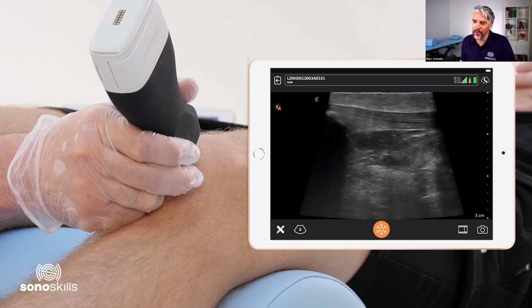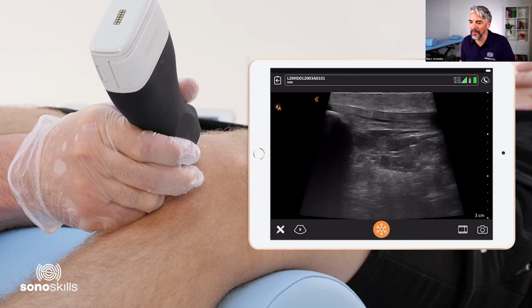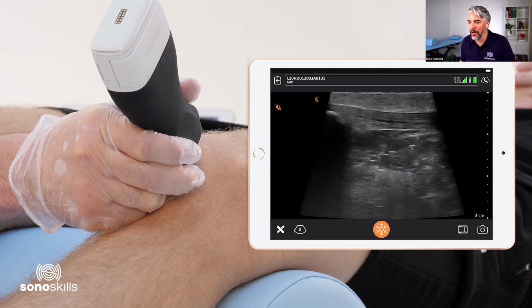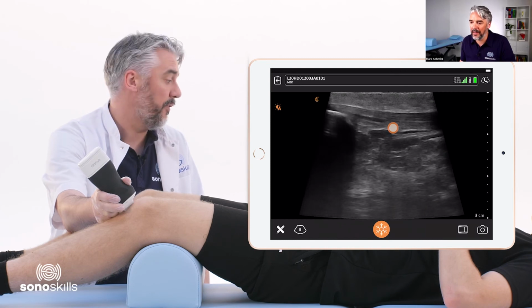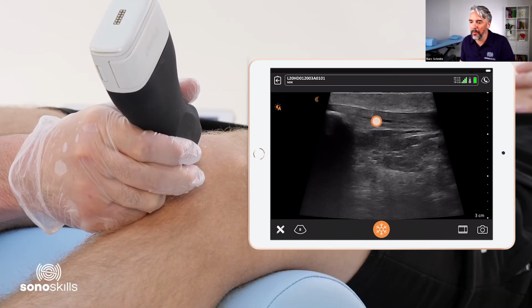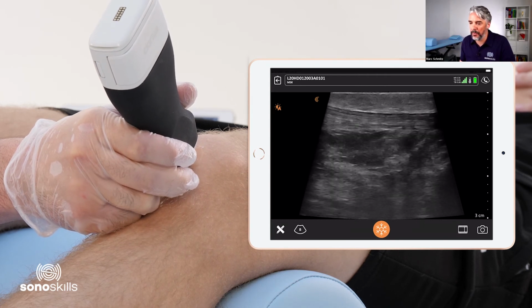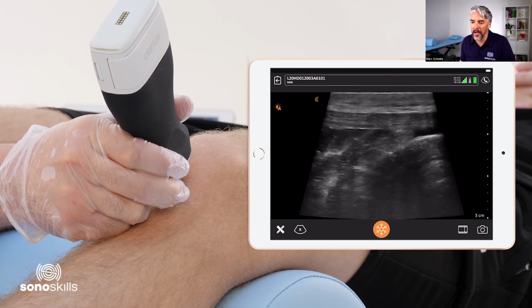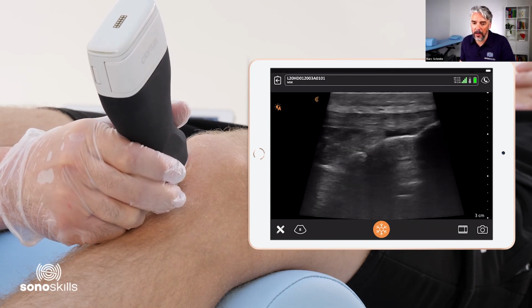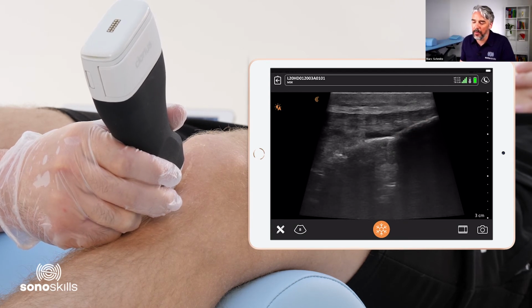And this is actually a small pathology. We see a tearing of the patellar tendon right there. This is a longitudinal partial tearing. We see an anechoic zone within the tendon. This is definitely a tear. And this is actually a professional football player, and I mean European football, soccer, whom we scanned.